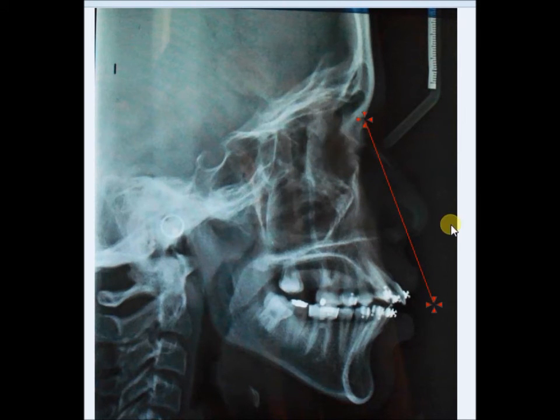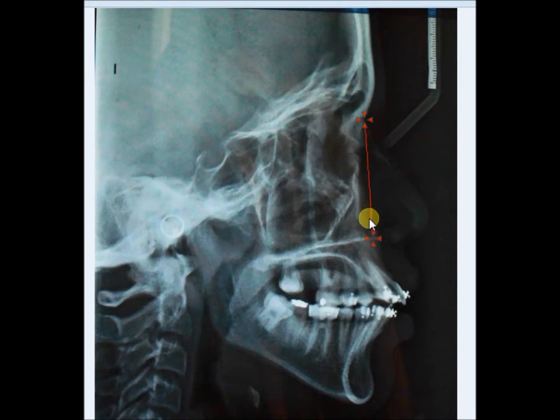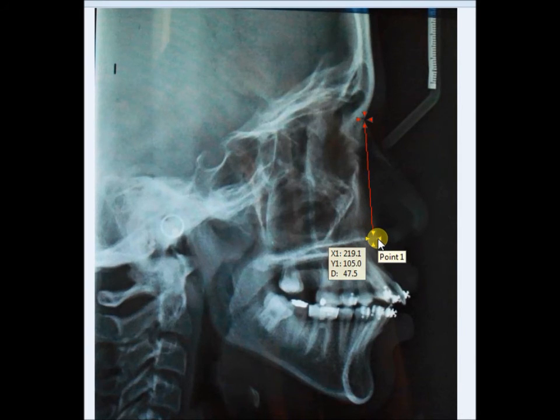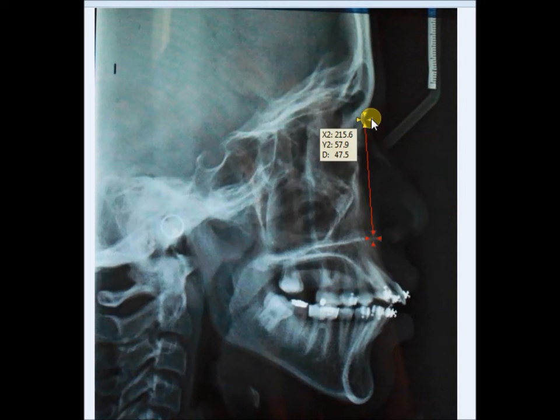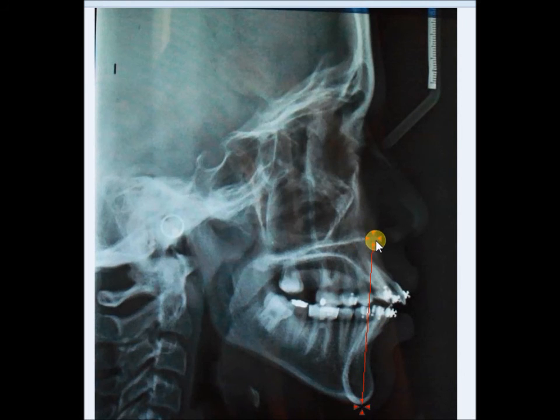Now I'll show you how to measure distances. Here we're measuring the mid-face length — from the nasion end point to the palatal plane — it shows 47.5 millimeters; that's the skeletal mid-face height. The skeletal lower face height is from the palatal plane to the menton, and here it shows 67.1 millimeters.